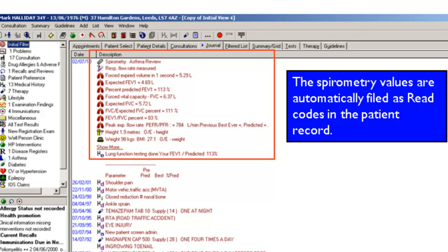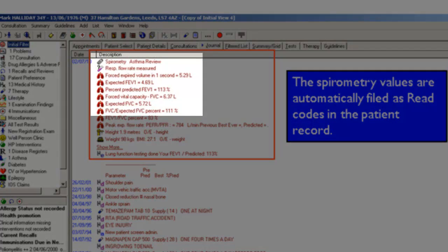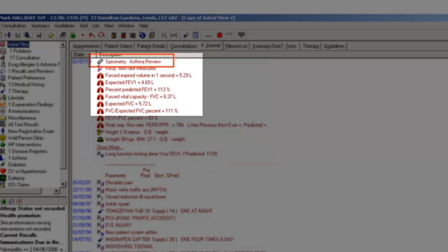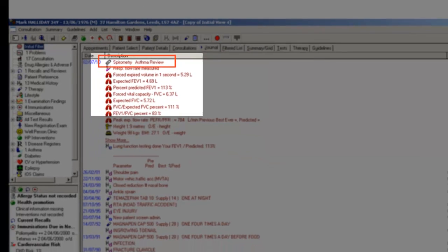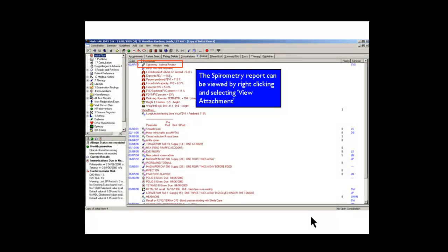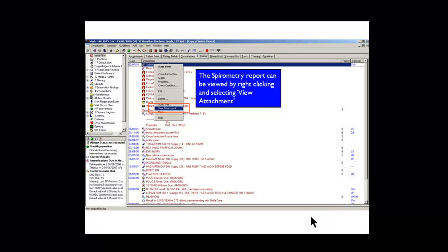We can also see there's an attachment, an asthma review attachment at the top here. If we click on that, right click view attachments, you'll see the PDF being displayed.